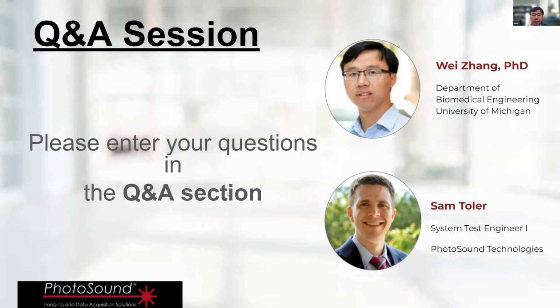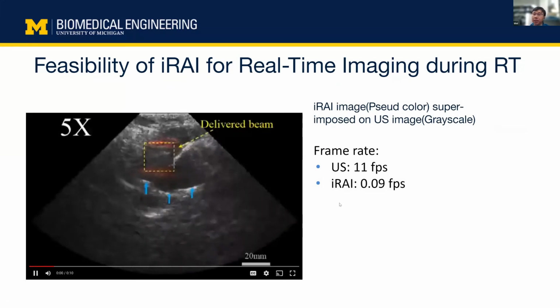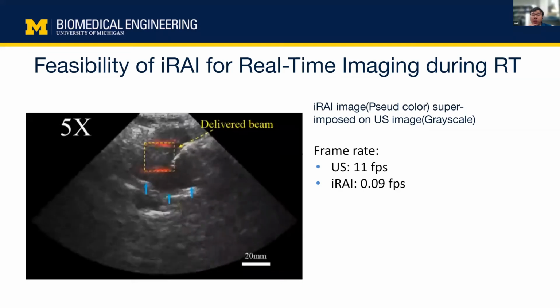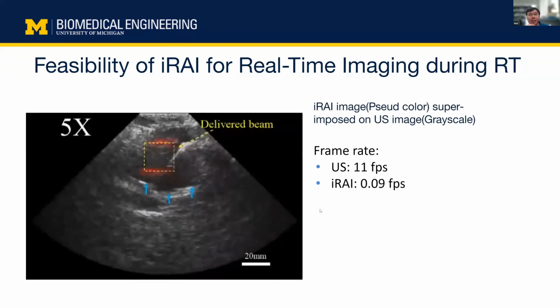So actually, the limitation for only seeing the boundary is not only related to the signal-to-noise ratio. It's also related to the bandwidth of the transducer. Most transducers have relatively limited bandwidth, which makes it difficult to detect the inner part, which has much lower frequency. It's also similar with photoacoustic. Yeah, we are currently learning something from photoacoustic in order to compensate for this.